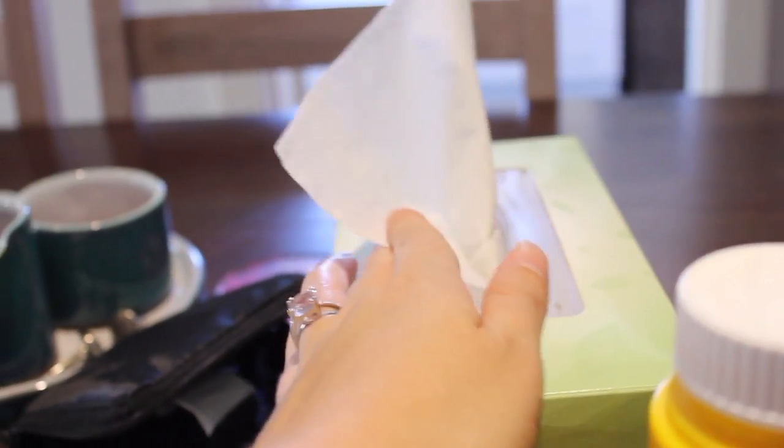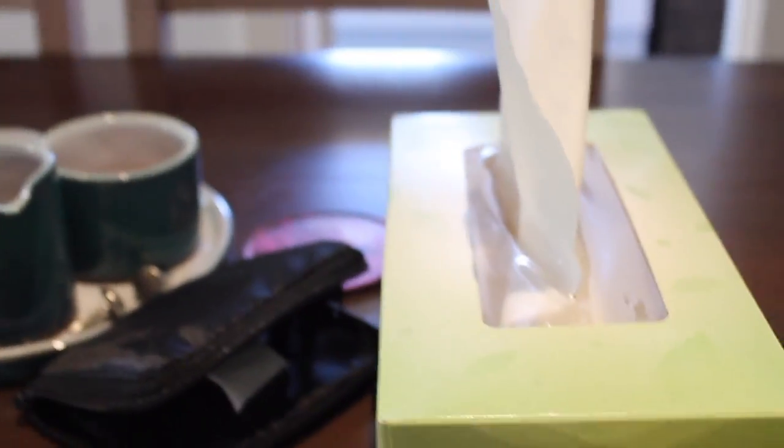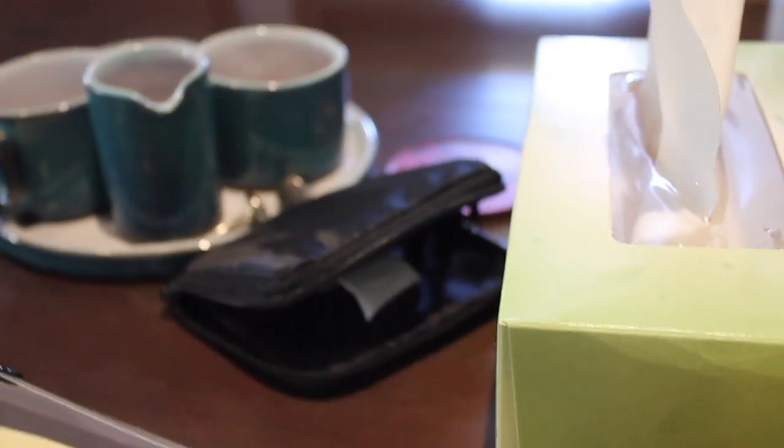Yes, and you do also need tissues handy to stop up that teeny tiny drop of blood that's going to come out, as well as wrap a test strip inside of it and then safely dispose of it in your trash.